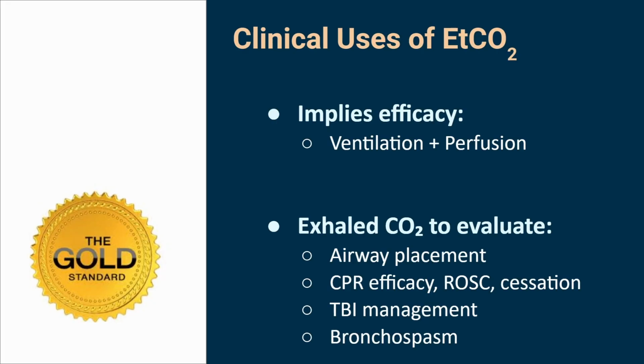So if I'm going to get a measurement of carbon dioxide, what must you have in you? Carbon dioxide, right? How do we get carbon dioxide? Well, through cellular metabolism. But that's how I get it in the cell. How do I get it out of my body? That's the ventilation part. So you can have an issue in either case. So it implies these things. It's not as perfect as I think some people say. Now, put simply, it's the gold standard for a lot of things. In fact, have you ever seen a nasal intubation?